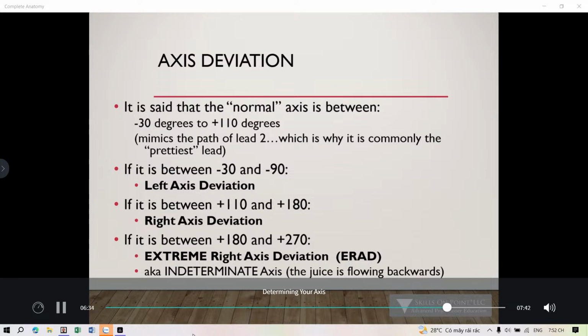Did you have some issues in the basement? Did you get some water? Was there some flood damage? Or who knows? Something changed in your foundation. Something changed in how everything works. Either you did an addition or something happened. You had a subtraction, so to speak, in your heart muscle. Perhaps you had an MI, and all of a sudden you don't have a lot of electricity going through that scar tissue, and now you've shifted your axis away from it. Or maybe you have a more complex issue going on, like a bundle branch block, and there's some damage that's caused a shift.